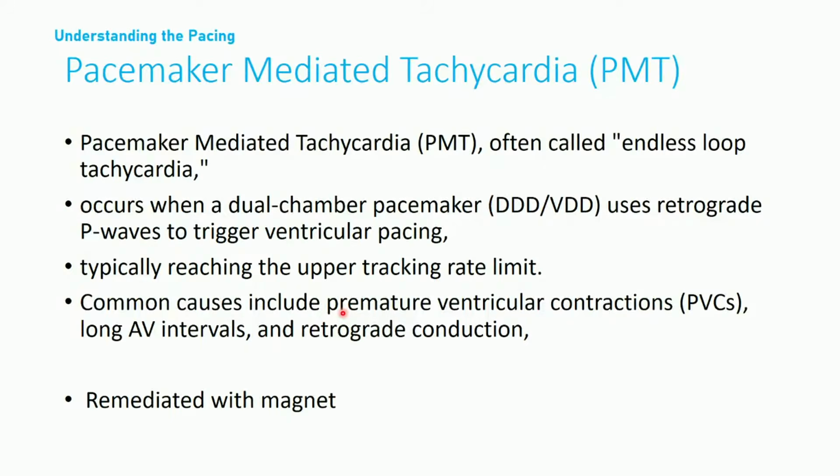Some patients I've seen in my career have asymptomatic PMT, pacemaker mediated tachycardia. Their heart rate is always at the maximum track rate, and they are asymptomatic. During follow-up, we found that the rate is still sustained due to the PMT.